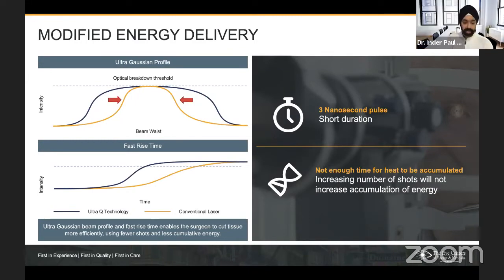I go by the number of shots, and here's why. Because of energy delivery, the heat is dispersed within 3 to 4 nanoseconds, and it's dissipated before the next shot is fired. Number two, it's such an efficient delivery of energy, and because of our studies looking at retina functionality, looking at VEP and ERG testing as well, we have not seen a degradation of retina functionality.